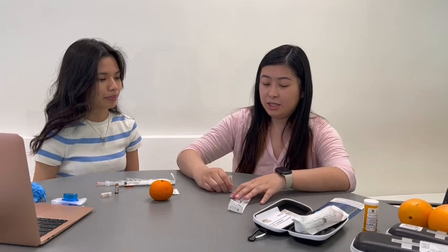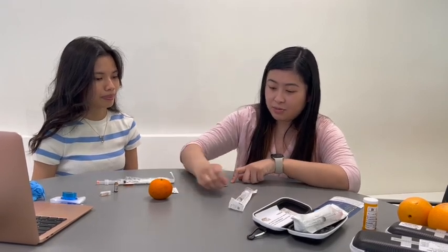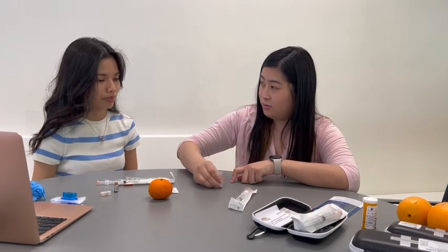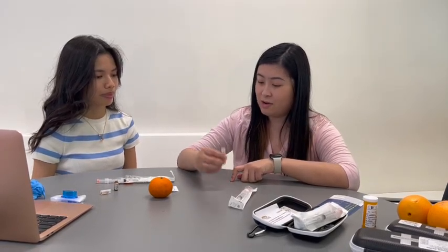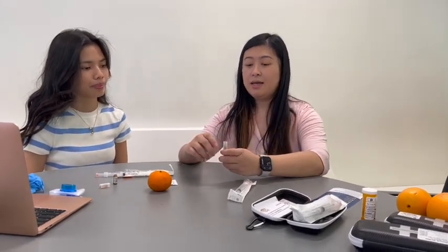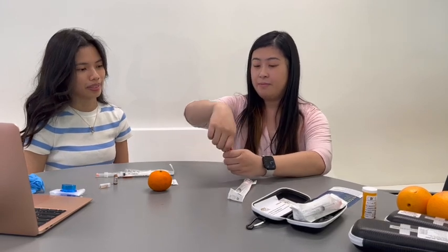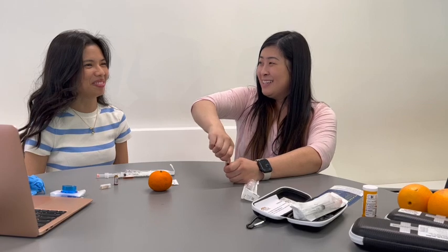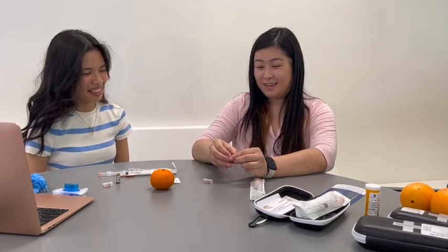Then with the medication, you said to use this motion to get the medication out from the neck, or I can do the revolve around the world. So let me just do that. No medications are in the neck, and then you said to break it away from yourself. Okay. Good job. Thank you.